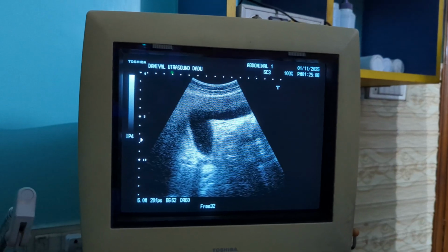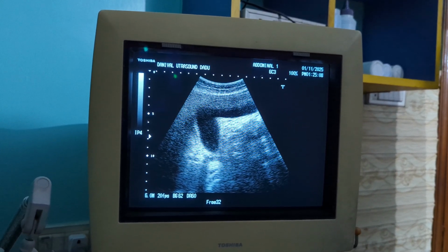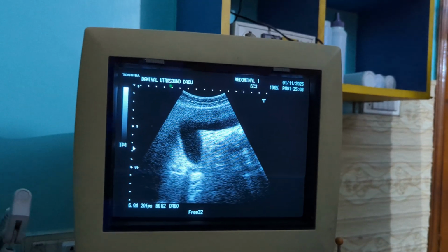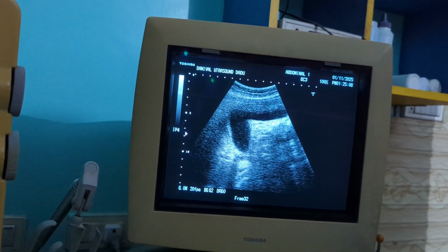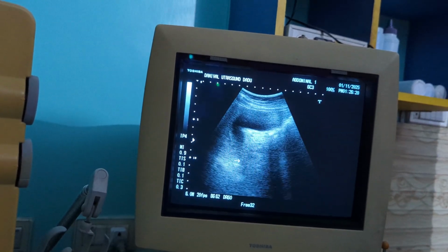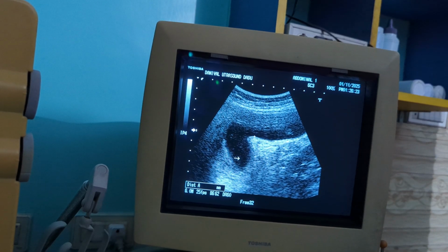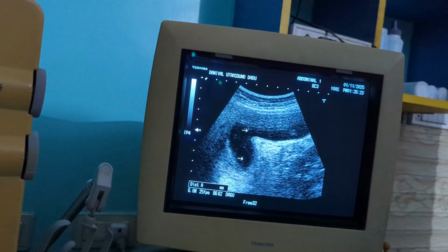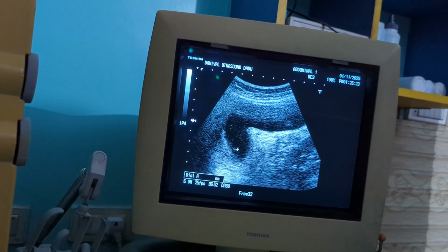So in cases like this, when the cystic duct or neck is blocked by the stone, bile cannot exit properly, resulting in gallbladder distension and sometimes mild wall thickening, which is here. I can show you. Here is the gallbladder wall thickening. You see here, this is the gallbladder wall, which is showing thickening all over.